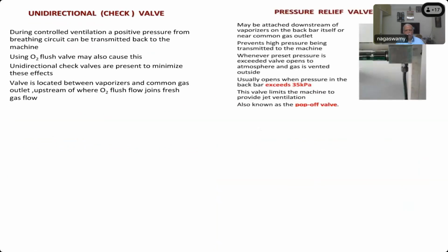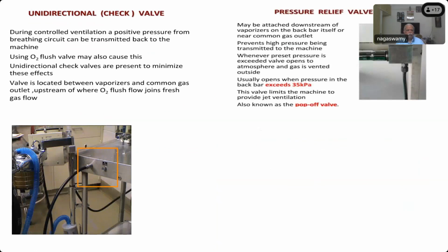The earlier ones we showed are all for preventing oxygen supply failure to the machine. Okay? So that is the difference.